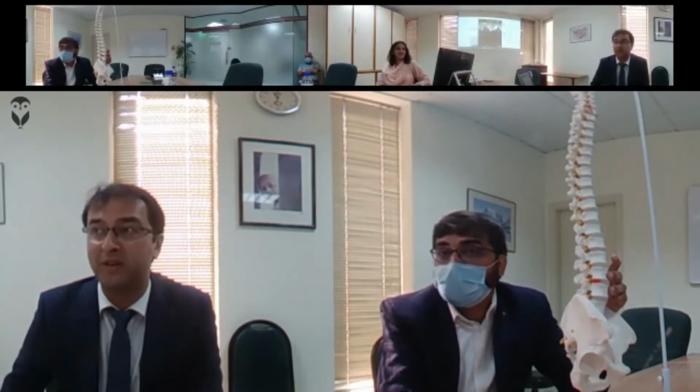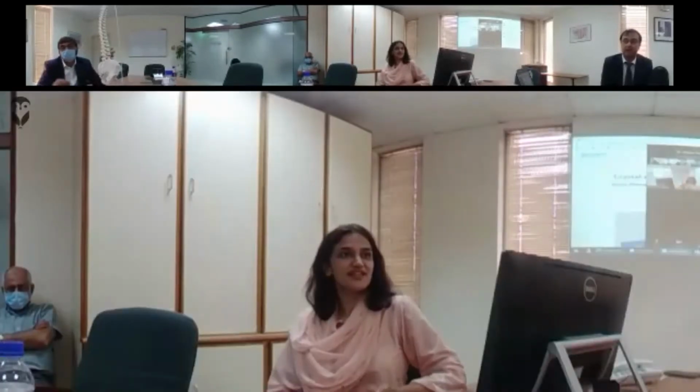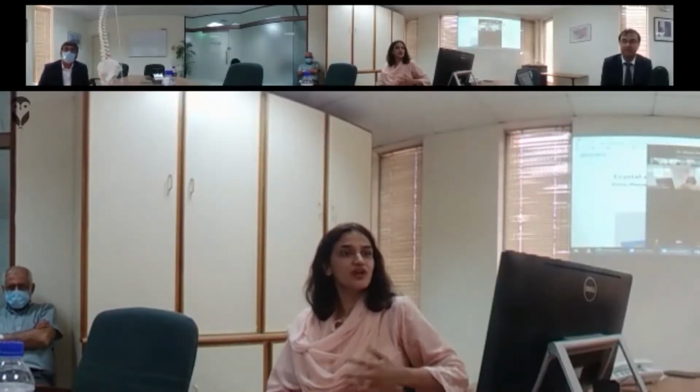Yeah, it's mainly the ventral spread. So it's the contrast that will give you an indication of how well it's going to cover the pathology.